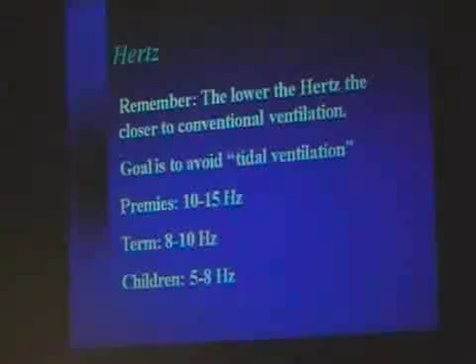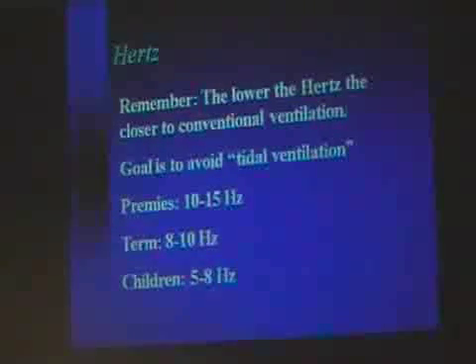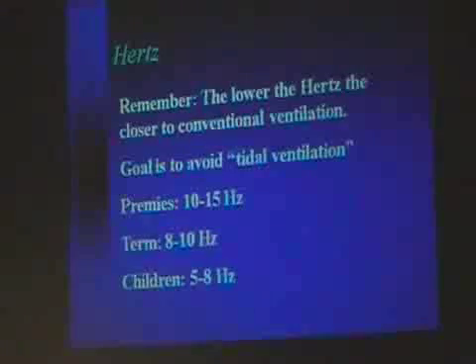All right, hertz. This is always a confusing thing, and it's certainly not totally worked out even among those who are studying it. Just remember that the lower the hertz, the closer you are to conventional ventilation, because your tidal volumes are going to get larger as you lower the rate. Remember the little picture with the tidal volume being just like conventional on a low rate and very much attenuated on a high rate. The goal is to avoid that tidal ventilation. The goal is to hold the lung open and just vibrate the lung with as low a tidal volume as you can.